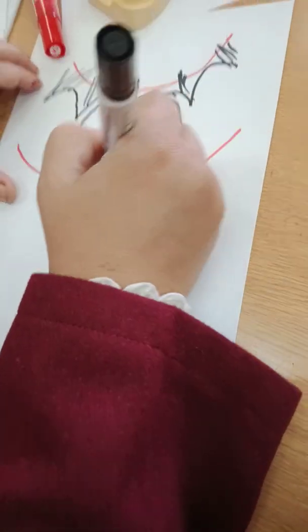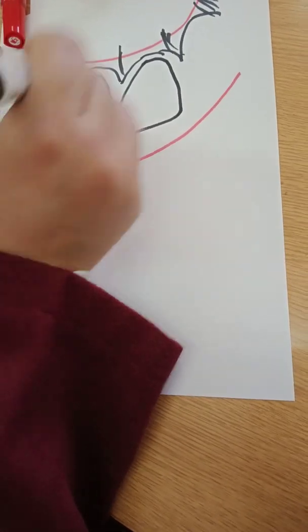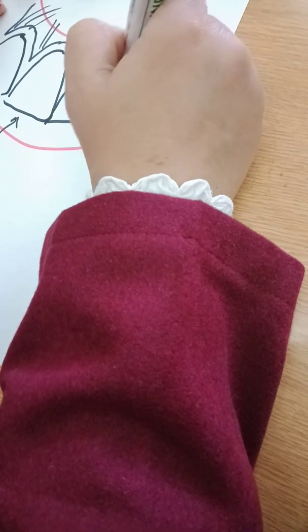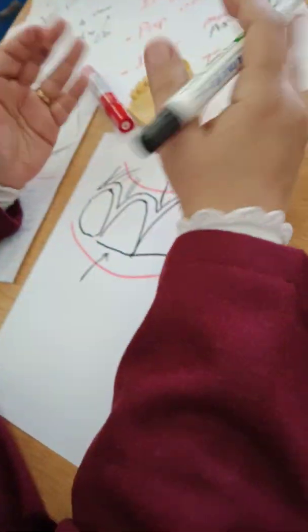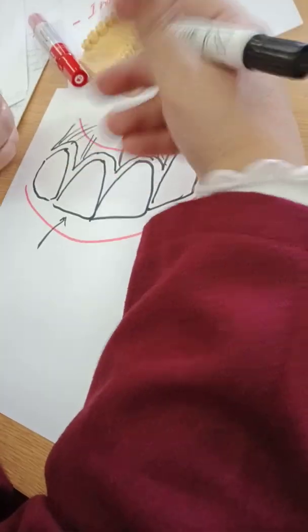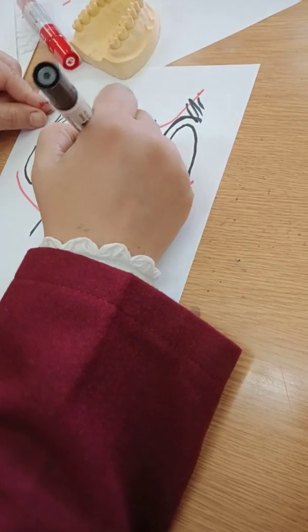I took it from where? From the cast, the study cast. Okay, it's made on the study cast. These are the actual teeth inside the index. Now, palatally, I leave it. I don't need it. But lingually, labially, I'm going to cut the rubber above the marginal gingiva by 1 millimeter. Meaning the marginal gingiva should be included in it.